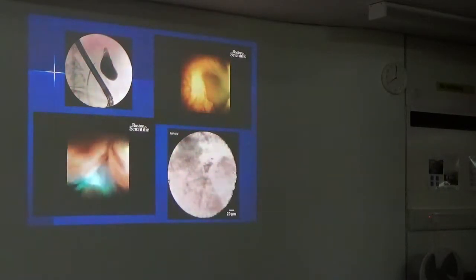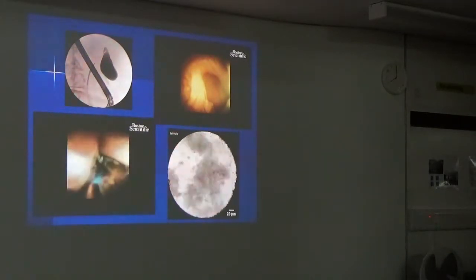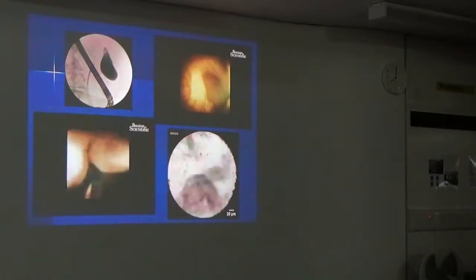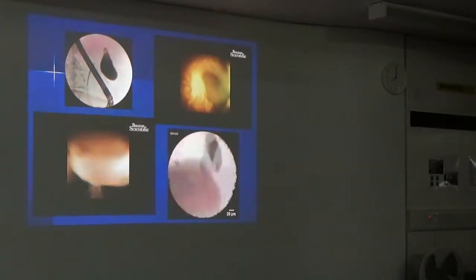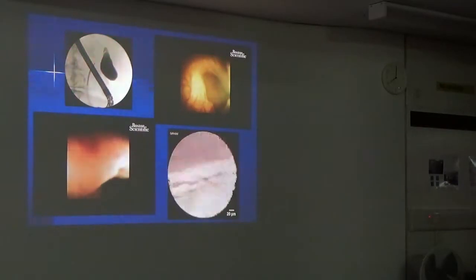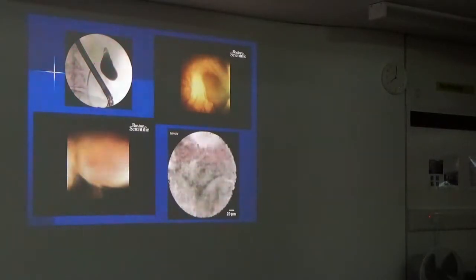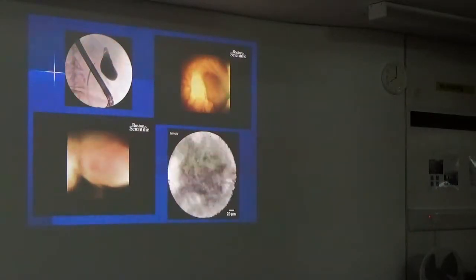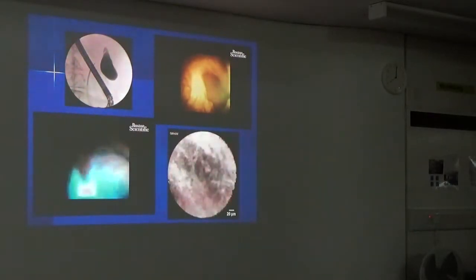and it looks like it's a flame or something. It's not. It's just the reflected light. There's no trauma from that. And then, if this will play, that's the view that you get, the microscopic image that you get on a screen from that bottom left hand corner. It can be difficult to interpret, but there are certain patterns that you can see, and in very specialised circumstances, it can be helpful.